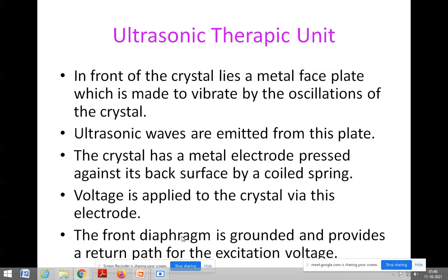The front diaphragm is nothing but what will be present at your piezoelectric crystal. Near that it will be used as the return path of the voltage generated in the piezoelectric crystal. Okay, return path, another path.